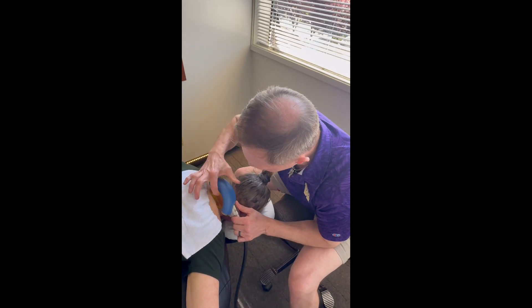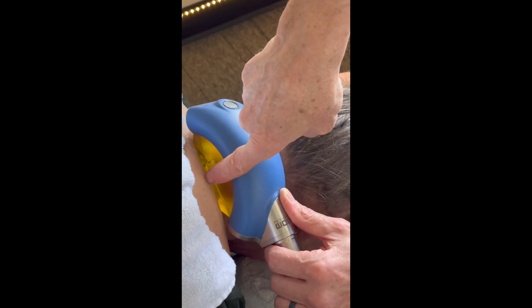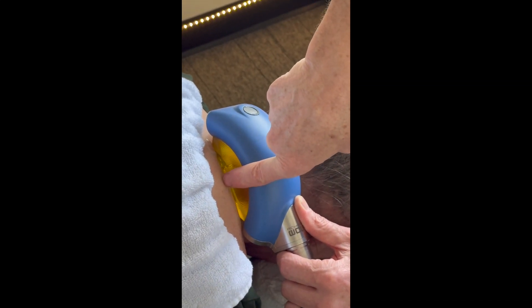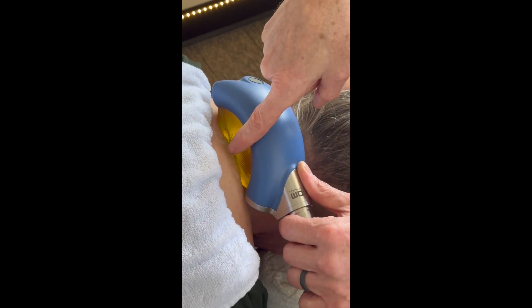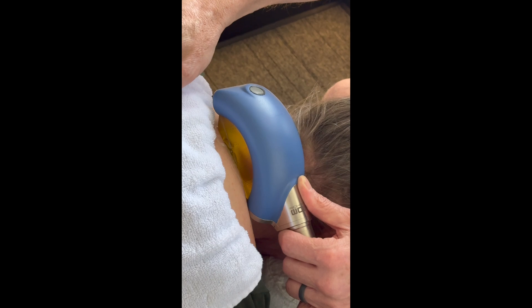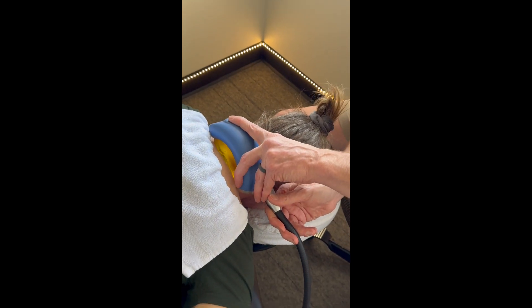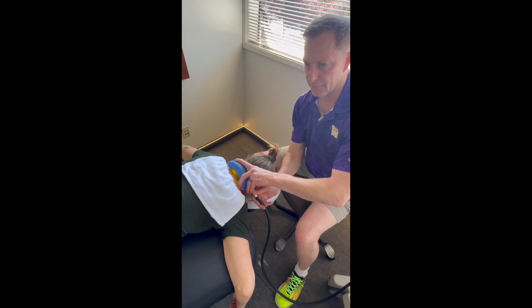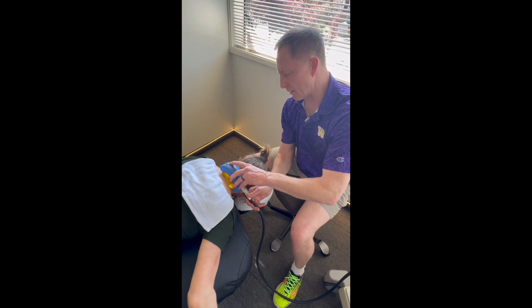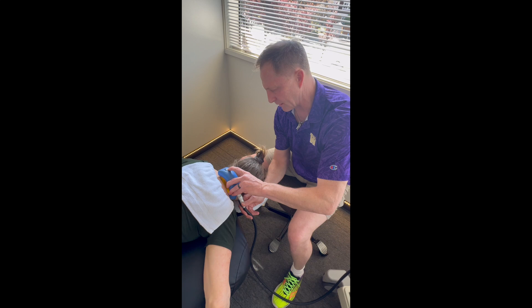The important part is keeping the perpendicular line on the gel pad perpendicular to the surface I'm trying to hit. I need feedback from the patient as to what she's feeling. Patient, you're going to feel maybe something, maybe nothing — I have it fairly low right now. You can hear the rhythm and rate I've set. I can go higher than that. She's not complaining — people often feel it right off the bat.